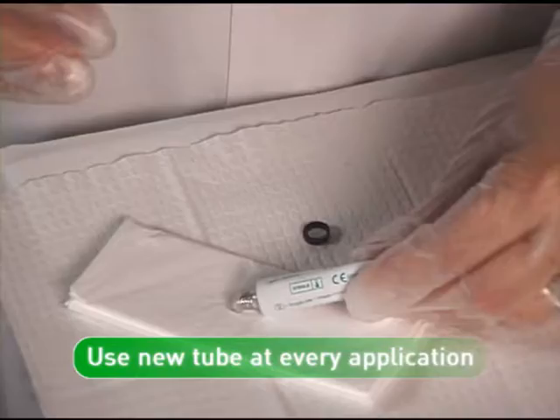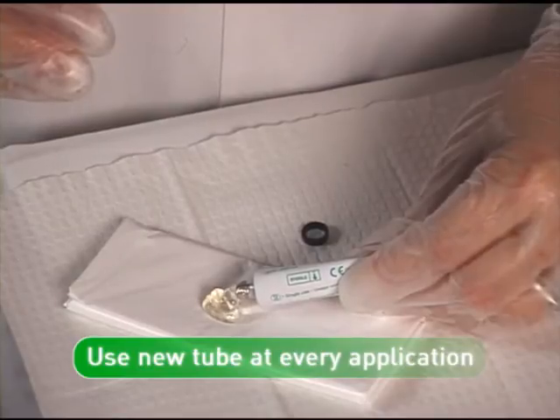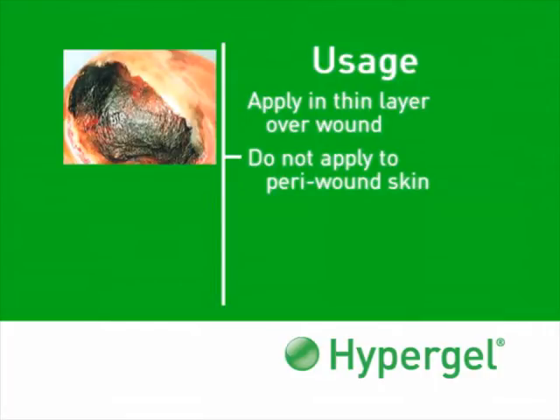Because Hypergel is preservative-free, a new tube should be opened for each application. Apply Hypergel in a thin layer, about the thickness of a dime, to allow the gel to penetrate and help soften the eschar. Care must be taken to avoid applying Hypergel to the peri-wound skin, since this could cause maceration.